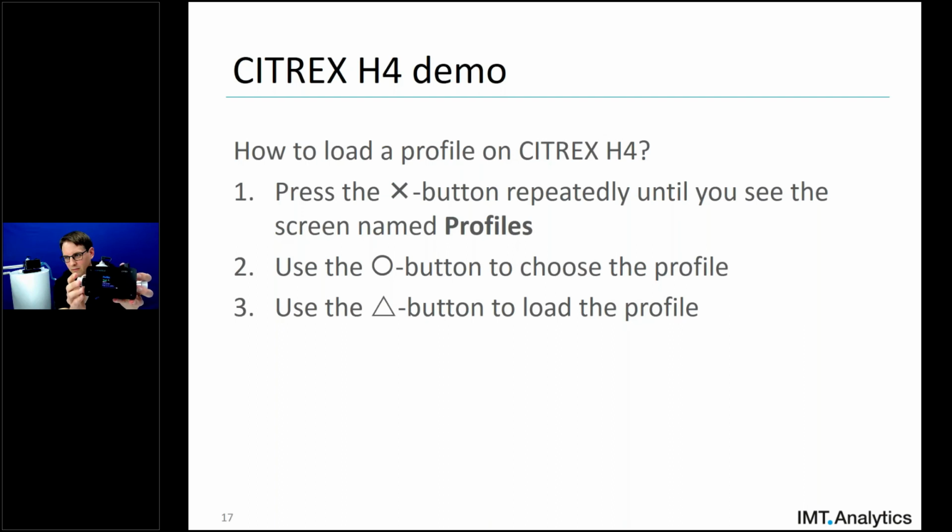And it asks me if I really want to load it. I have to confirm again with the triangle button like this. And now this profile has been loaded on my CITREX H4. So you see, it works a bit different. The concept is exactly the same. You need the tool here, which is saved on each and every SD card of your CITREX H4 device.